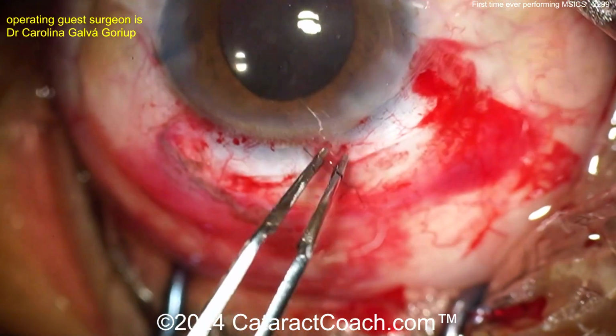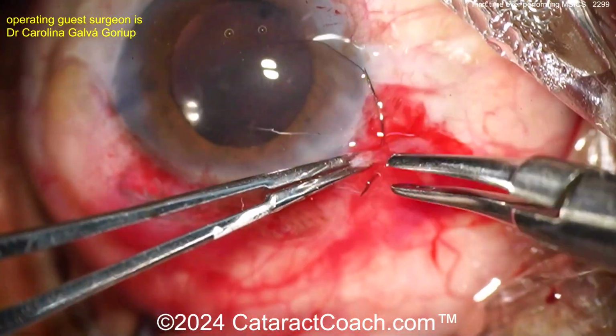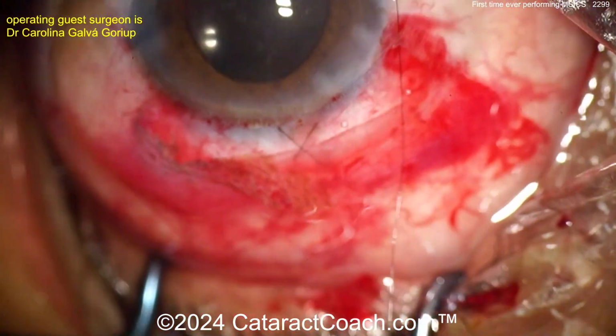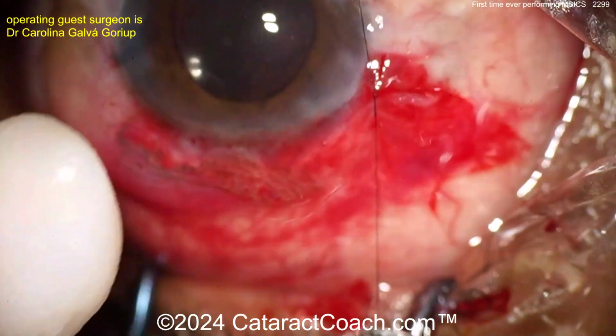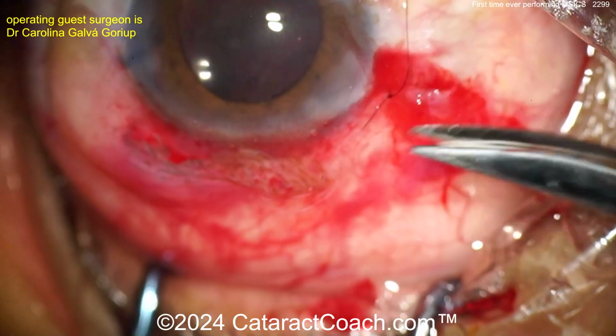And it's a little X suture. I like that one too. And now remove the viscoelastic here. Here's the conj closure. So you can use cautery to close the conj. You can also use a Vicryl. You can use a nylon like this, whatever makes you happy here. Get a good conj closure here.